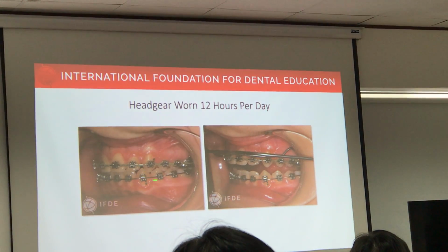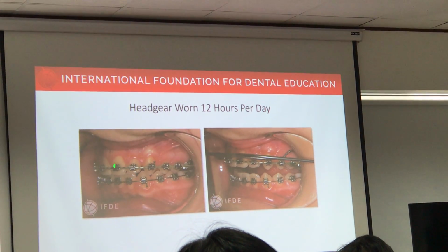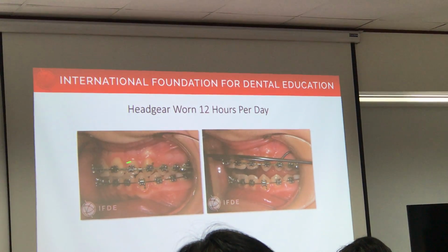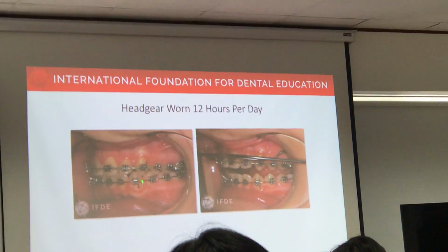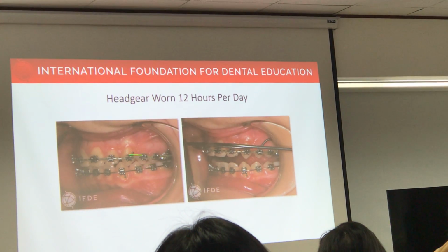And the problem we have when we procline, and again these ones were broken a bit, that's all I can do, but they were there before anyways, is when you over procline with functional appliances, the overjet now is reduced, but the teeth don't match in the back.